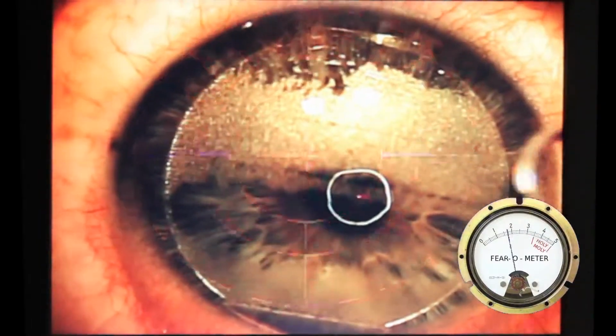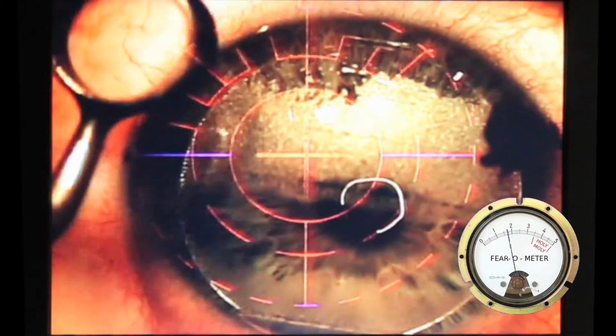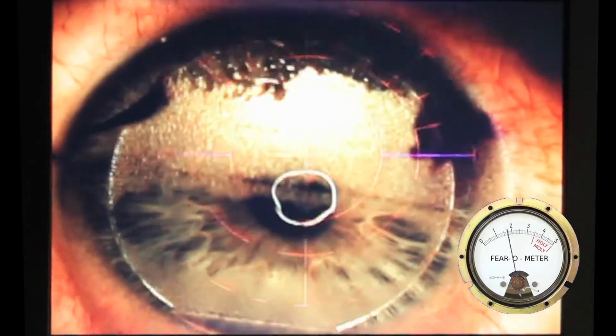Here, we'll do the same thing in fast motion here, so you can see him. Mark it, and then pull that joker back.